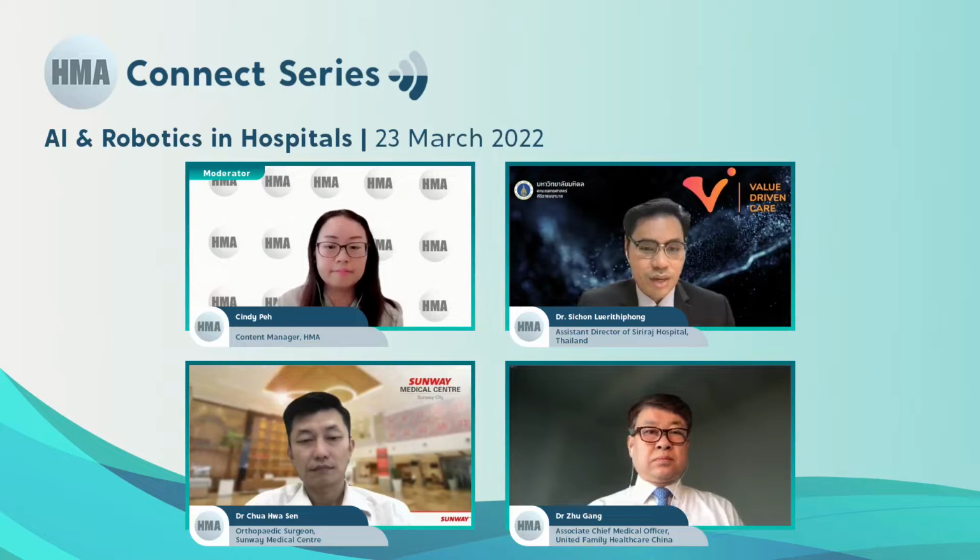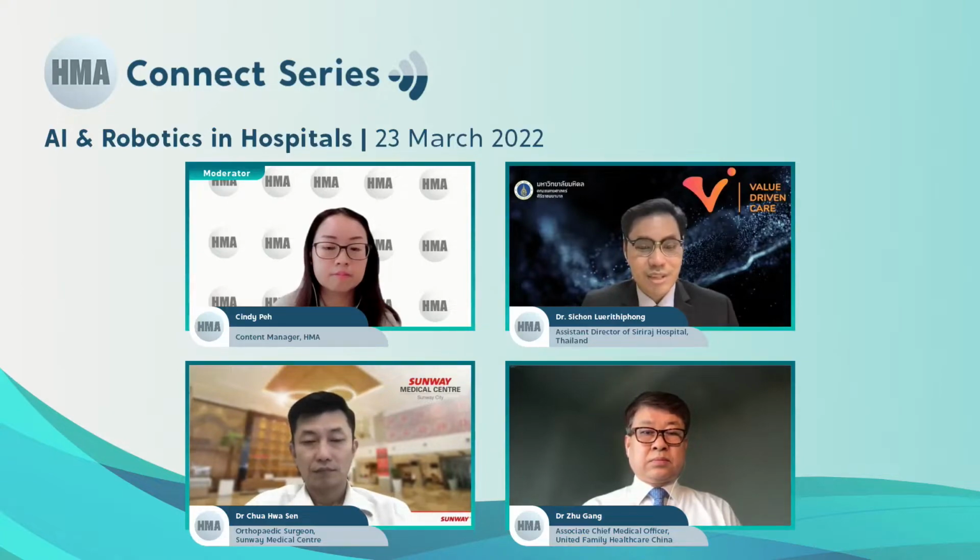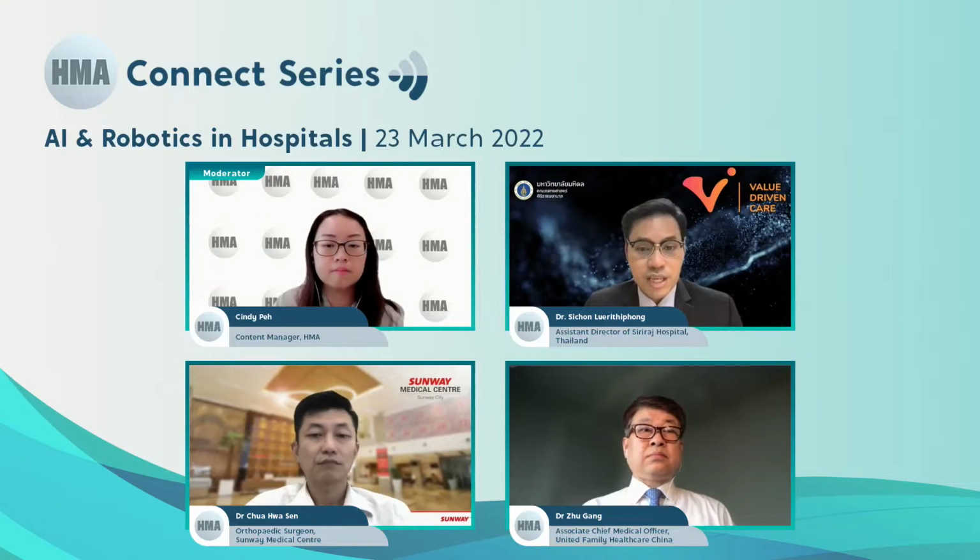And then the second one that our professor from the Department of Ophthalmology developed together with a department of engineering from another university is a system used for diabetic retinopathy screening. So instead of the patient coming in and waiting to see the ophthalmologist, they can just go directly to another department, take the retinal imaging, and just go home and wait for the result to be sent to their home. And then the latest one is about the AI pathology.